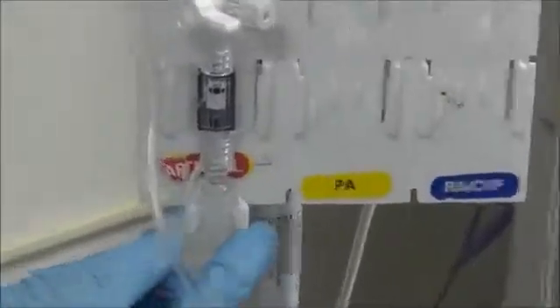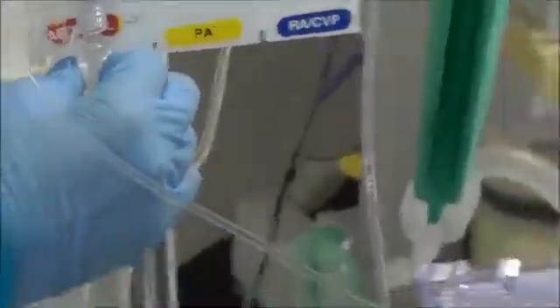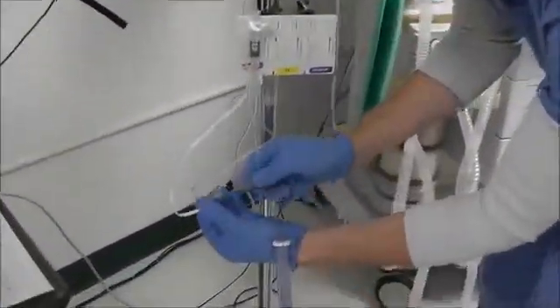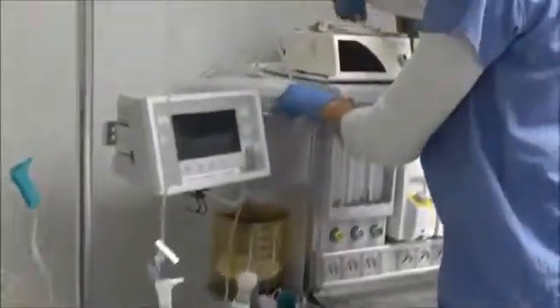Here's how you flush it. Push in. Push in, and allow all the air to come out of your tubing. Okay, and we see that all the air is out. We have flushed the A-line. We're almost done here. The only thing that we need to do now is come down here and connect the transducer cable to the transducer, and then plug it up into our monitor up here.